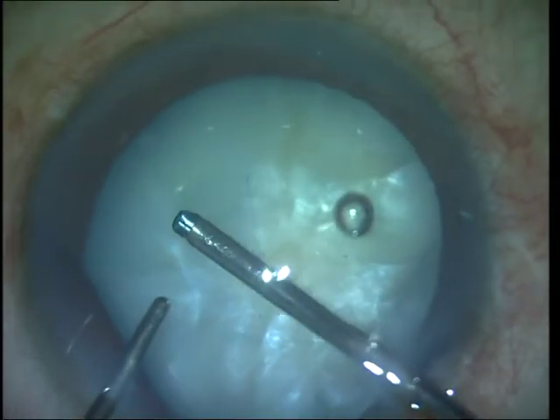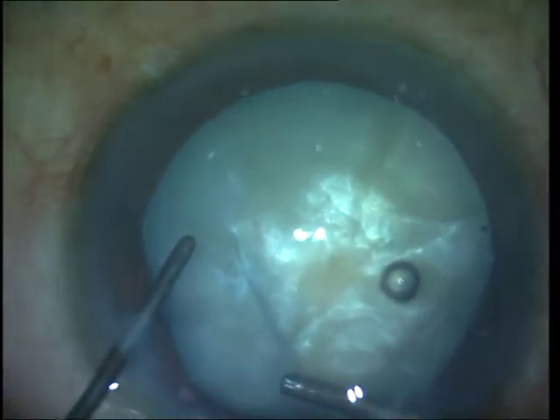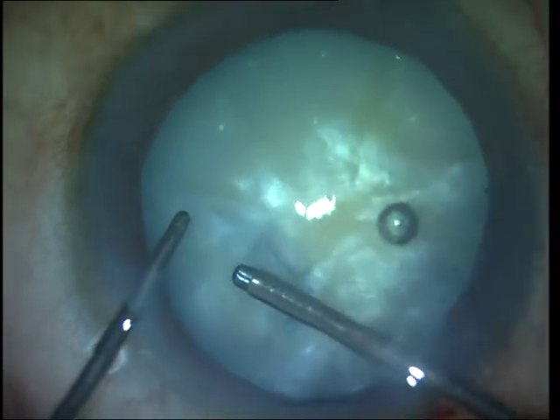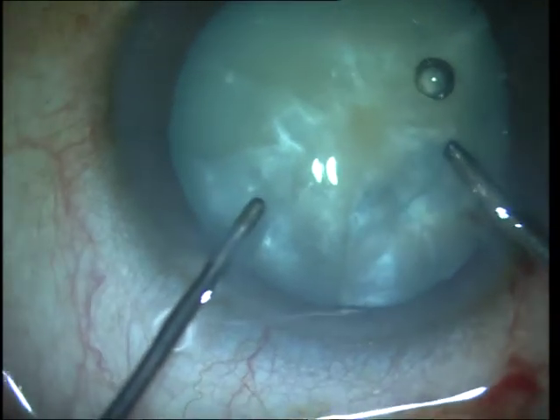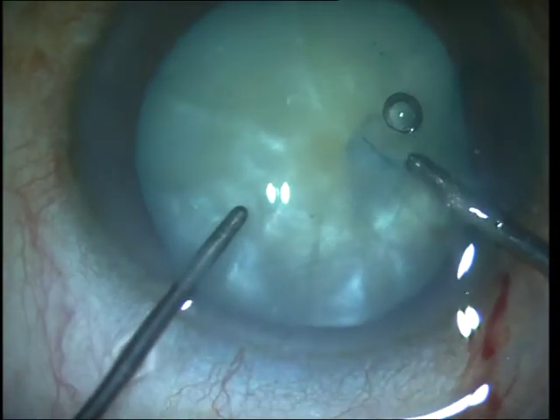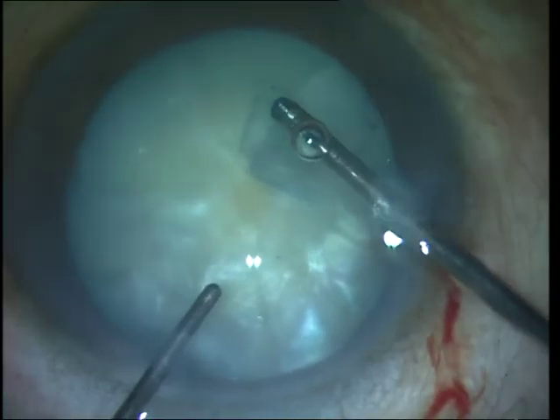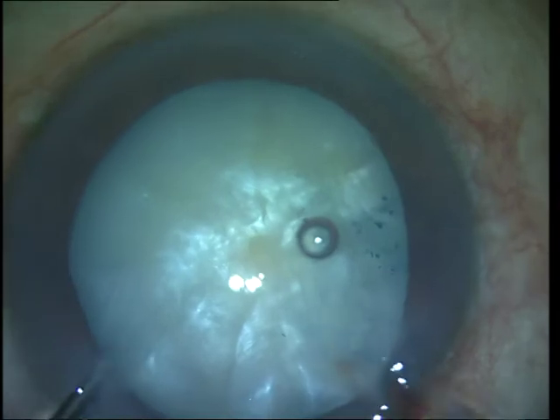Since I was finding difficulty continuing with a 26 gauge cystitome I changed over to micro forceps, which gives very good control. In this case I have created a capsulorhexis of the desired diameter; however, you could also spiral out your rhexis as shown in the previous video in case you feel you might inadvertently get a radial capsulorhexis extension.